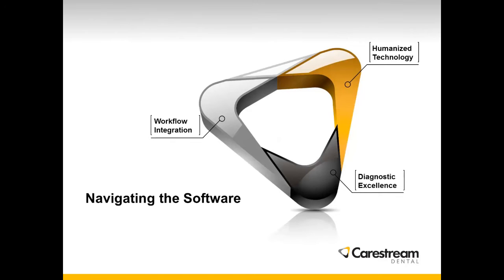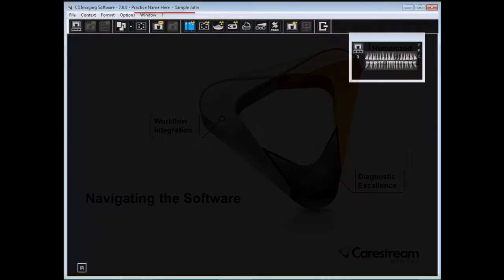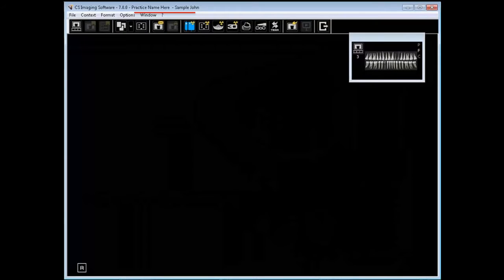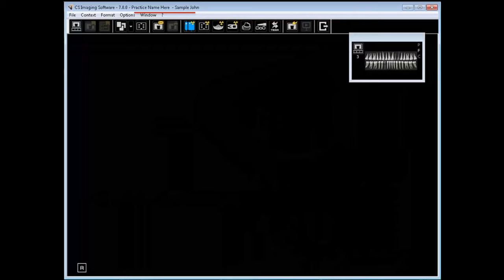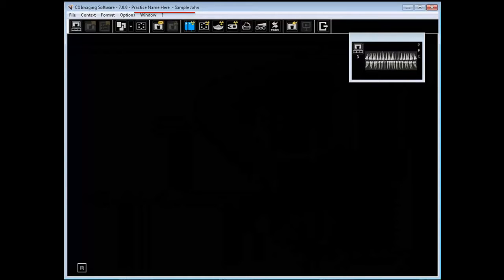Once the patient has been selected from either the patient browser or your dental practice management software, the CS Imaging software is displayed. At the very top, the software name is displayed as well as the version, and then the practice name.